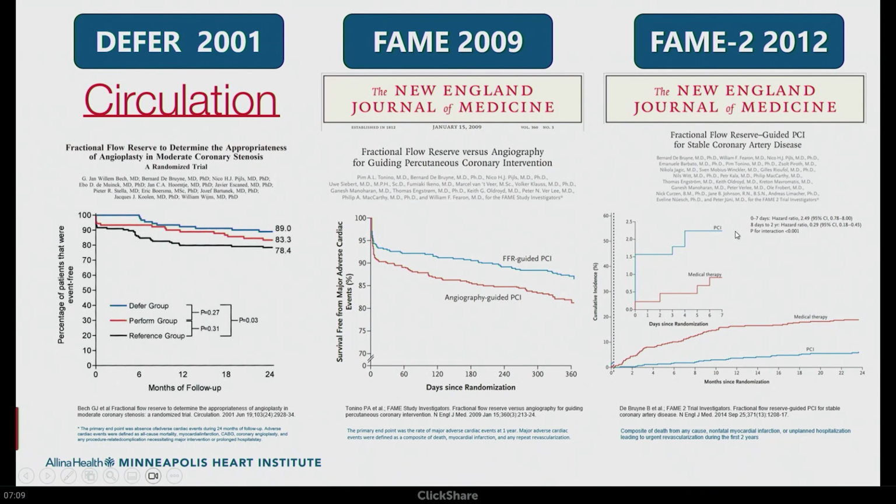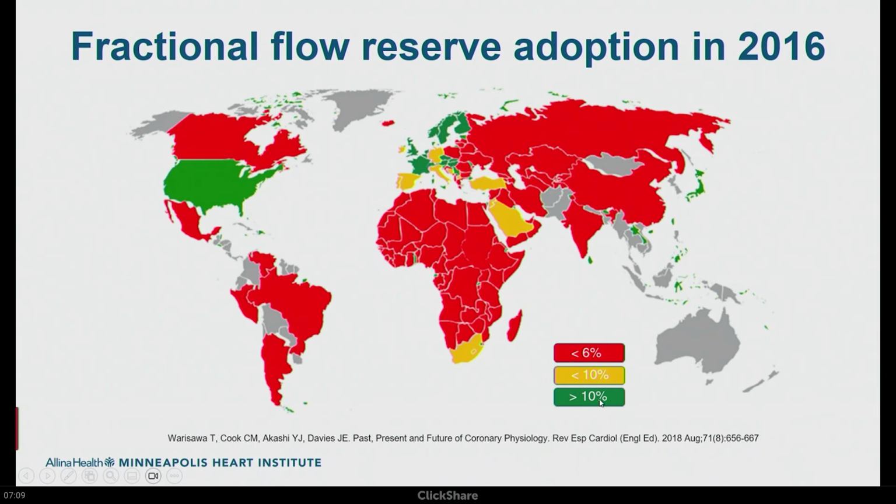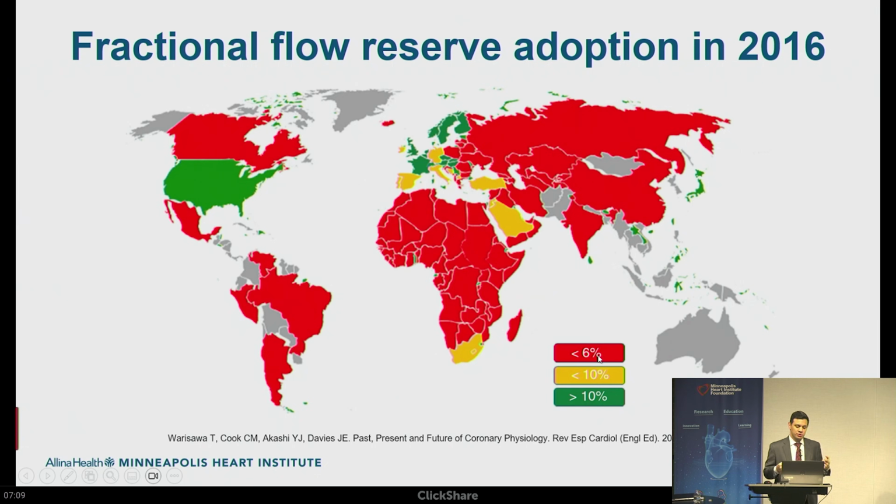But also in the FAME trials, particularly FAME2 that I showed the 5-year outcomes at the beginning of the presentation, if you use coronary physiology to identify patients that have ischemia, that is superior to angiography-guided PCI, and even medical therapy to reduce myocardial infarction. And this is what established the use of physiology. Now you would say this is all great, we should be using it all the time, right? Because of course we want to do precision-based PCI and make sure that you are using these technologies to the best of our capacity. Now this is the latest data that I know that shows this as clearly.